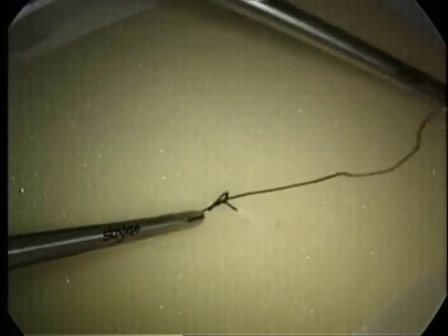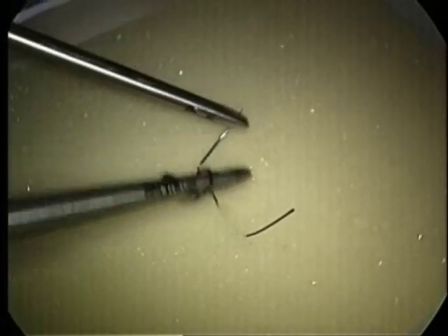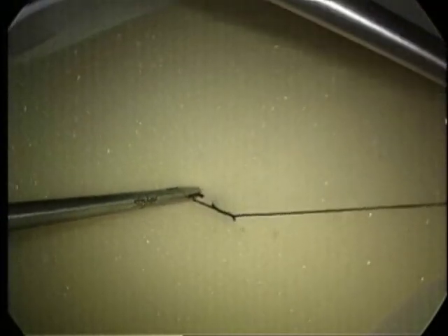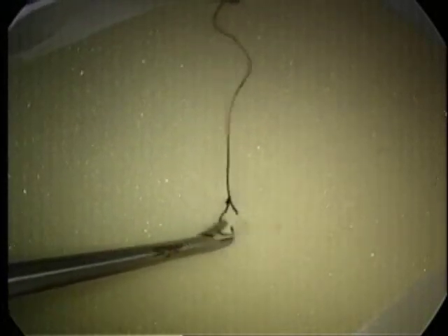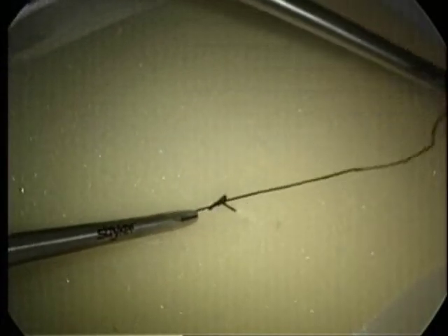The third and final wrap is a single clockwise wrap. The left hand is to the left of the knot and the right hand rotates clockwise around the suture, grasping the short tag. The left or non-dominant hand then goes to the one o'clock position while the right hand goes to the seven o'clock position. This completes the laparoscopic surgeon's knot.